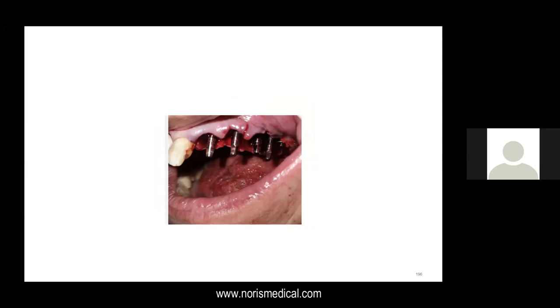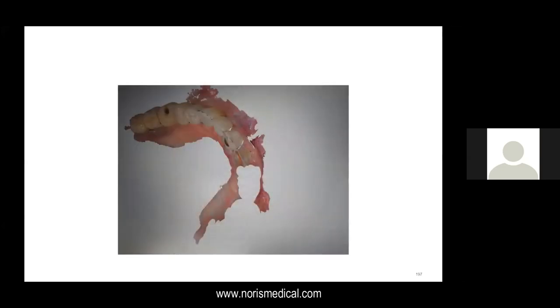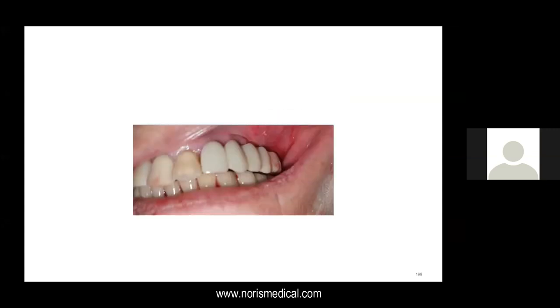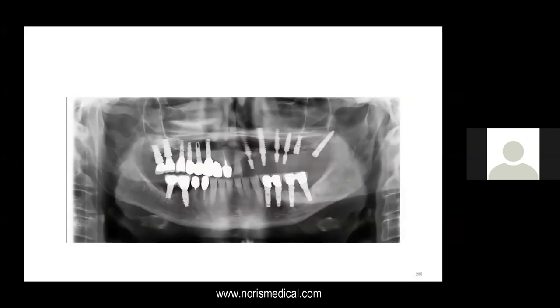Note, by the way, that the neck is always going as much as possible below the gingiva. In this case, I took a pre-scan. Here you can see how it looks. Again, this is the scanning, and this is the final bridge that she got 1 hour and a half after the procedure.